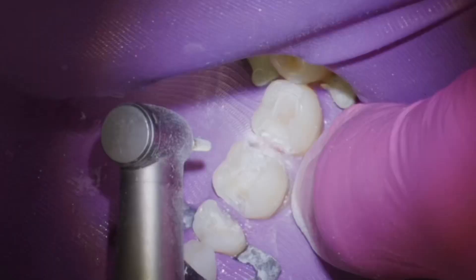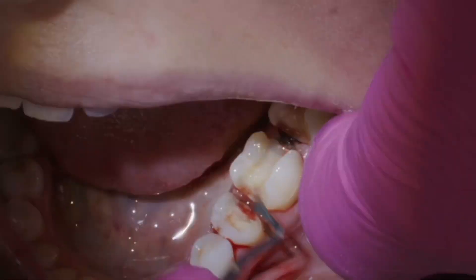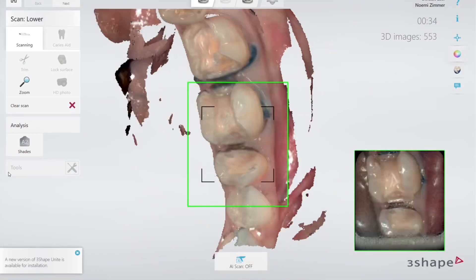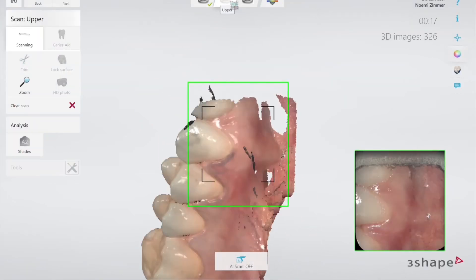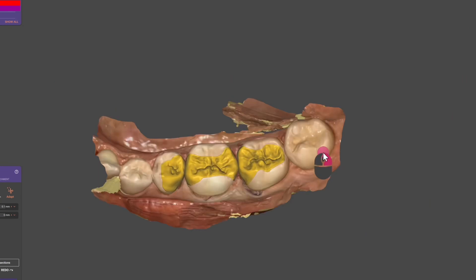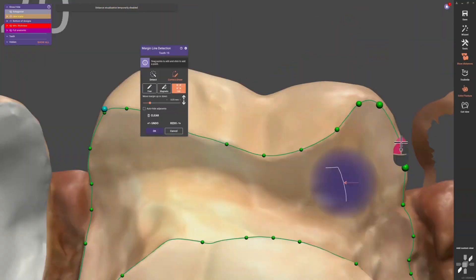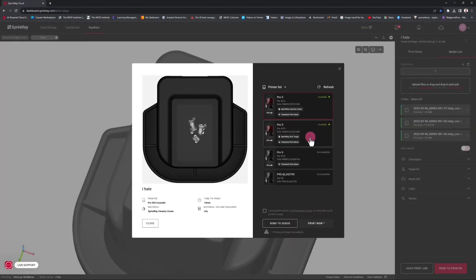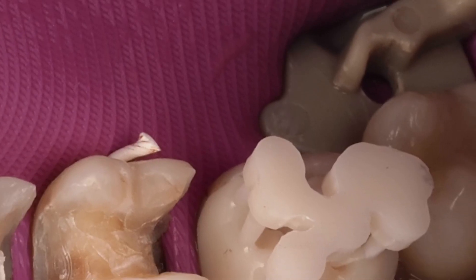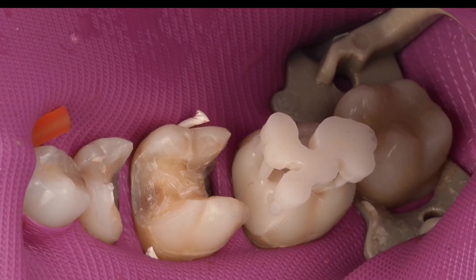I'll refine my preps, scan everything in after some cord packing, and go ahead and mark these margins in Exocad to design some inlays. These are meant to be printed — they're going to be printed in about 10 minutes for all three of them. Then we'll reestablish isolation and try them in to make sure they fit well.